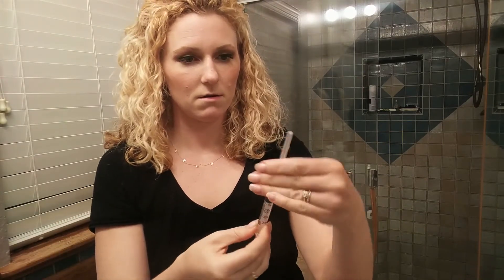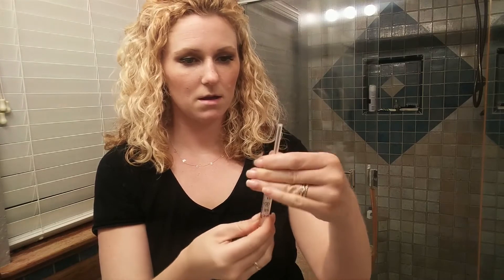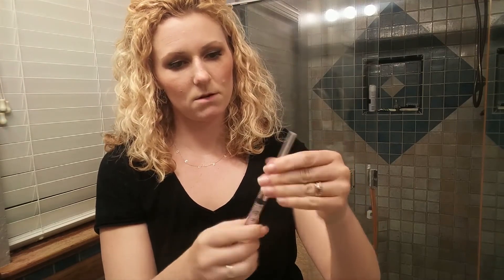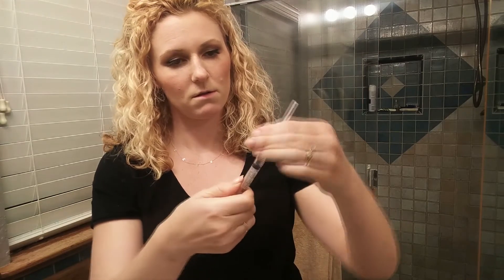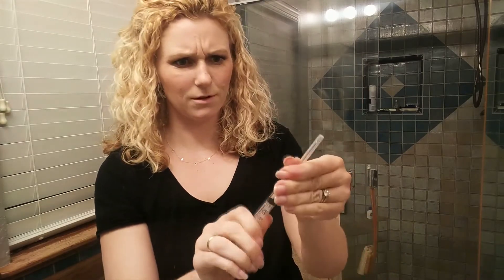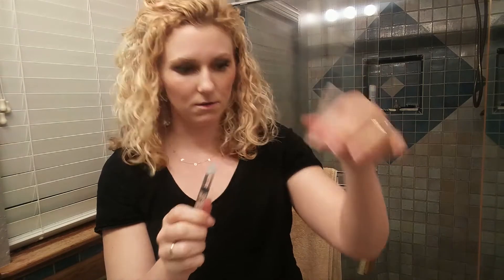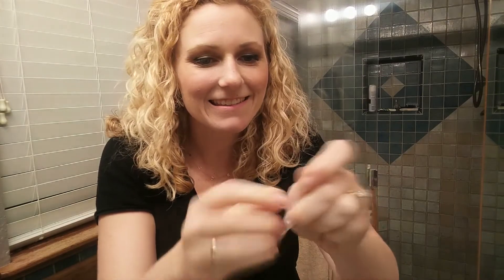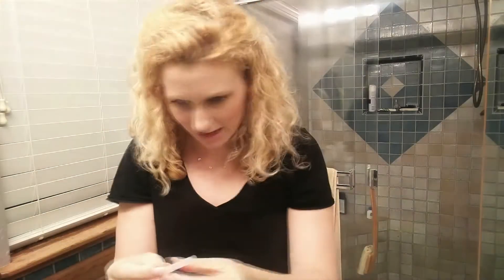Then we're going to cap it. Needle off — put it in the sharps container. And then we get our injection needle, which is teeny tiny. It's easier to inject with this guy. Twist that guy on.